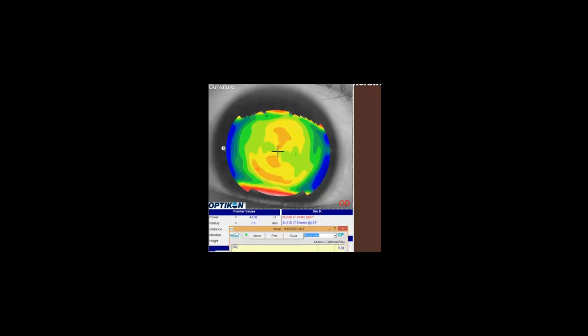But keeping in mind with this patient, I believe of Asian descent, with some potentially tighter lids, that lid-lens interaction may cause that lens to want to either ride along this meridian or this one. So I might recommend that you try to use the shape of that cornea to your advantage and maybe get some back surface toricity on that lens to see if you can mimic that.